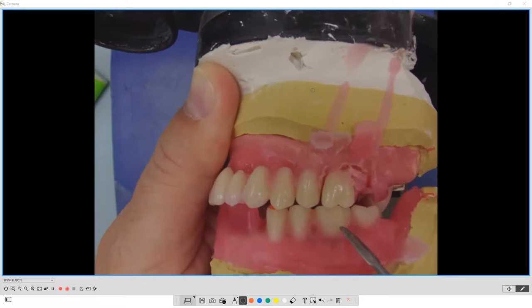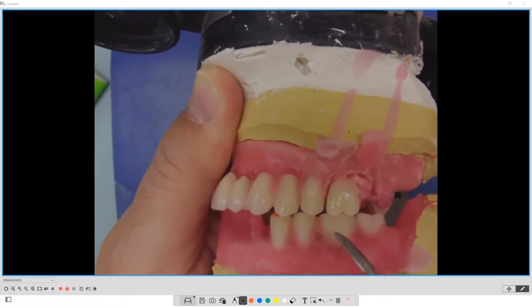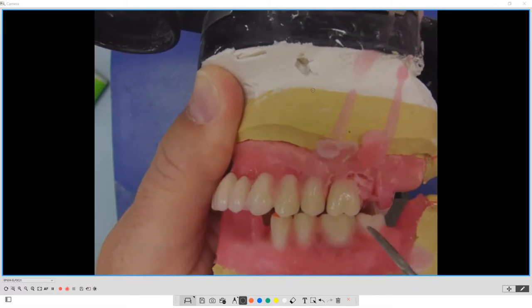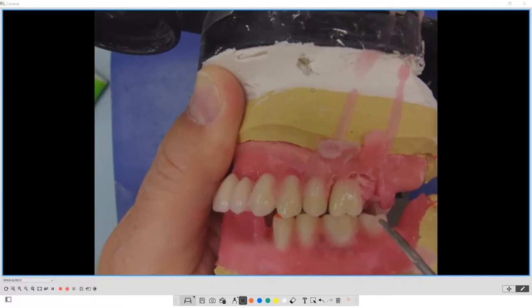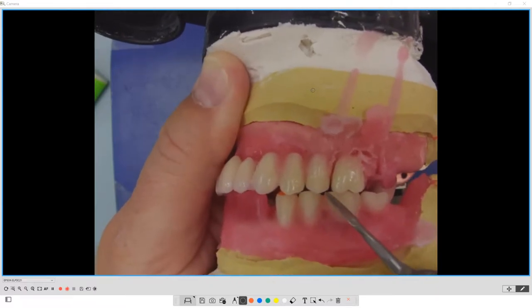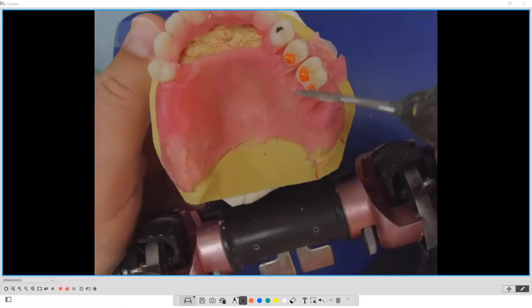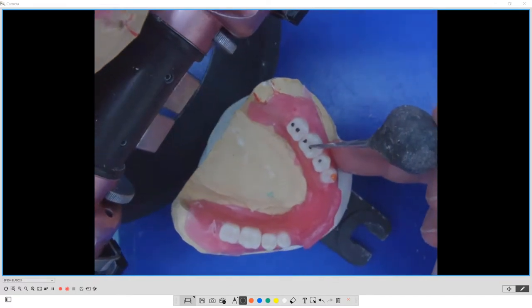It's a little bit different than what we're used to with a standard 20 degree setup where everything was more knuckle tight. It cannot be knuckle tight. That doesn't work anymore. That's what causes a lot of our grief, everyone. You have to open it up because the food's got to get in here and it's got to stay to get crushed by the crusher in the bowl that's bringing the food up. It's got to do that.